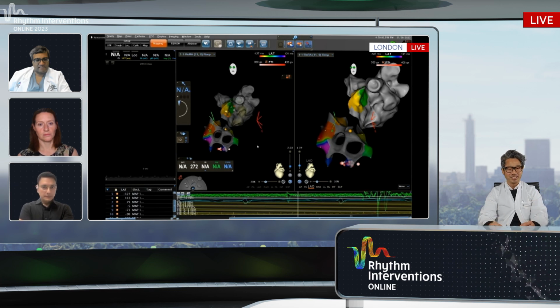Still, I think there are many open questions. What to ablate beyond this right inferior PV, what to do with potential induced atrial tachycardia, potentially induced AFib. But this is the good thing. We still have a lot of room for future discussions and driving our own ideas. So this is actually what I would like to come up with. This very, very good case, and maybe just one last round of 30 seconds for each of us to summarize this case from individual perspectives.